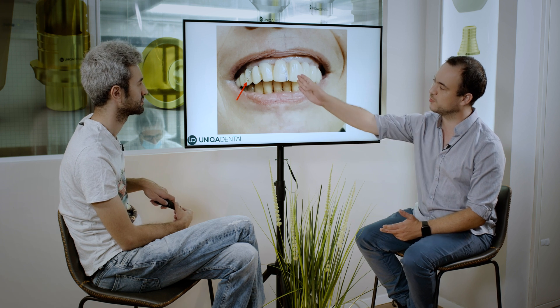To correct the offset before this provisional bridge is very hard. First of all, you have two teeth — you need to remove from this one and this one because the width of the teeth needs to be exactly the same and symmetrical. So you need to remove a lot of material from the teeth; it will interfere with the cementation process and it won't hold. You don't want to involve the teeth too much — you want to keep her old teeth and make new ones. It's temporary, just three to four months. It looks much better than the previous teeth. There's a slight shift, but later on we'll fix it of course.